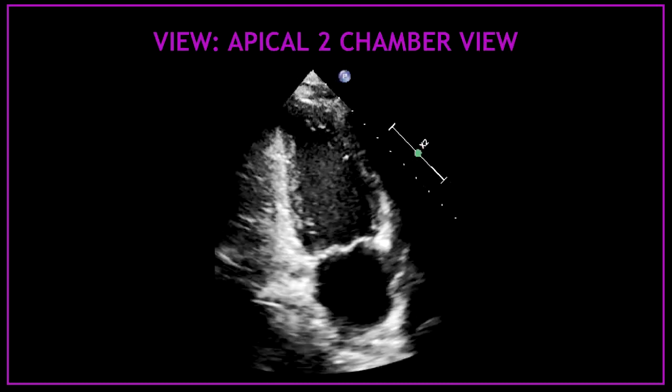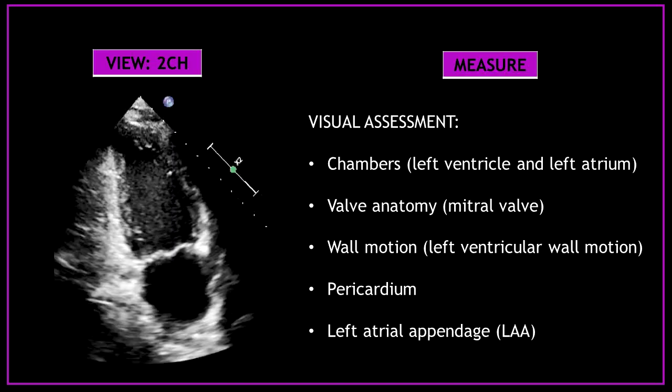Let's start with the apical 2 chamber view. First, obtain an apical 2 chamber view and perform a visual assessment of the cardiac chambers — the left ventricle and the left atrium. Also visually assess the mitral valve anatomy and the left ventricular wall motion. Don't forget to have a look at the pericardium and the left atrial appendage.